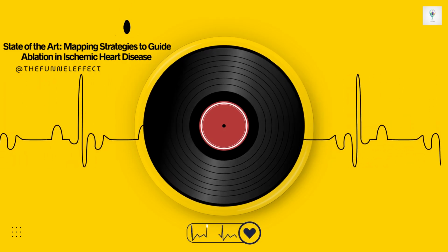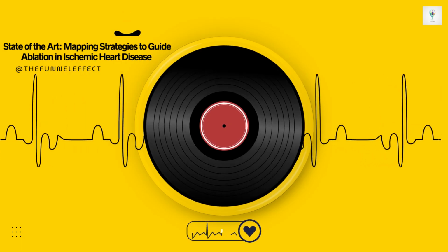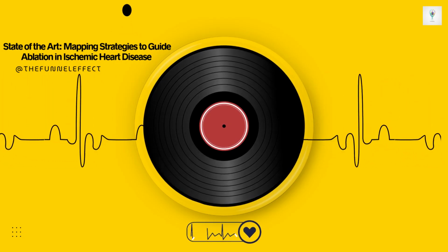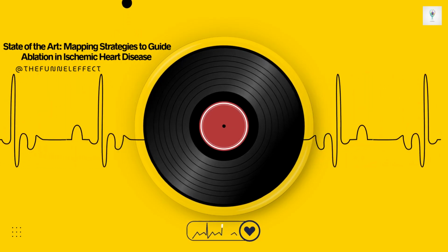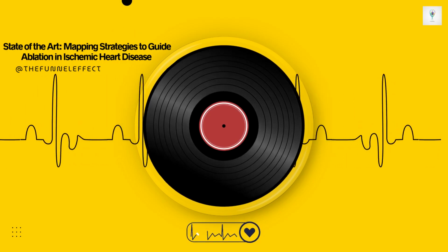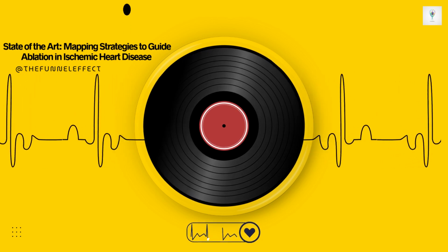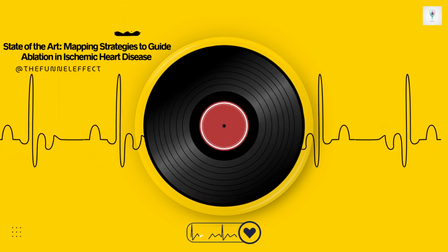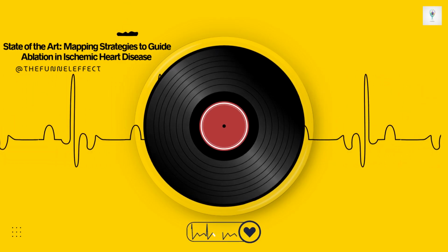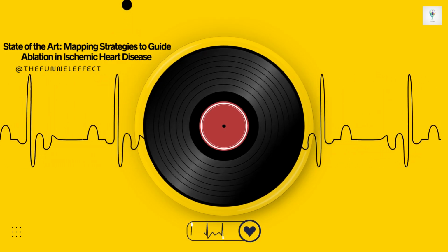Correct. The PPI is the key measurement. It's the time interval from your last pacing stimulus until the next naturally occurring electrical signal, electrogram, recorded at that same pacing site once the VT resumes its own rhythm. Here's the critical part. If you are pacing from inside the reentry circuit isthmus, the electrical wave you initiate travels around the fixed path of the circuit and returns to your pacing site. The time it takes for that round trip, the PPI, will be almost exactly equal to the natural cycle length of the VT, VTCL. So PPI equals VTCL.